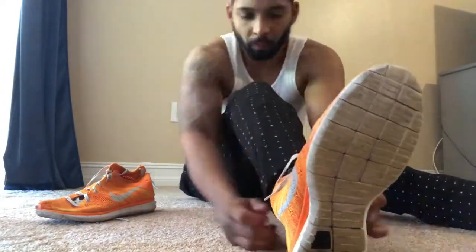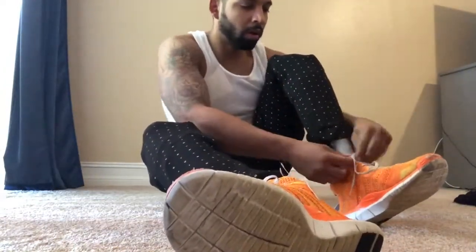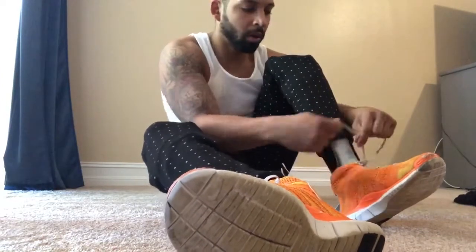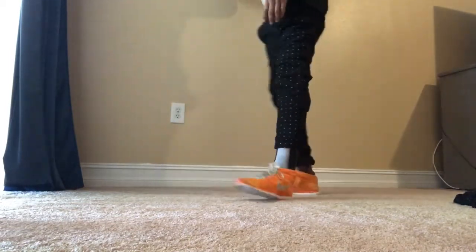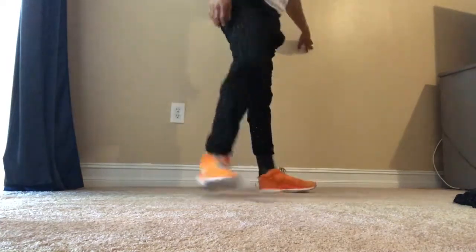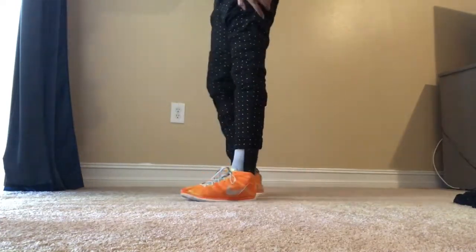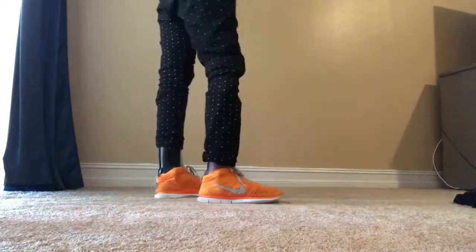Almost done here. Pants down. Put the right shoe in. We're almost there. Tying the shoe. And we're up. Showing off the legs — one can lock, one can't lock, but sometimes it's like that. Looks good. That's all we need.